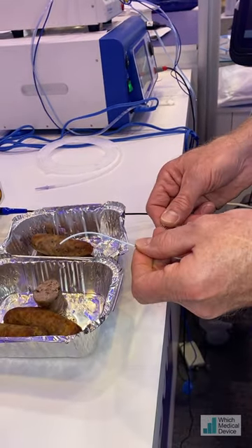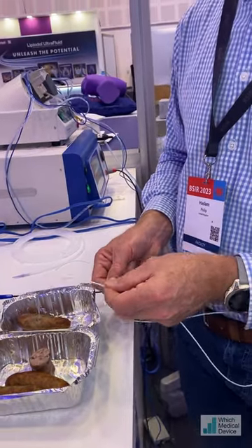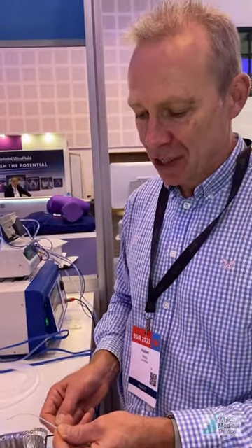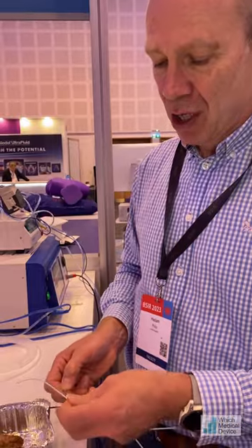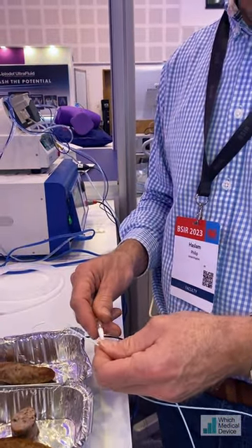Then we can adjust this and point it in different directions. So you can imagine if you had an occluded ureter with TCC going into the bladder, you could steer this into the bladder, burning your way through with different pulse lengths until you can recanalize it — basically put the guidewire in and place your stent.